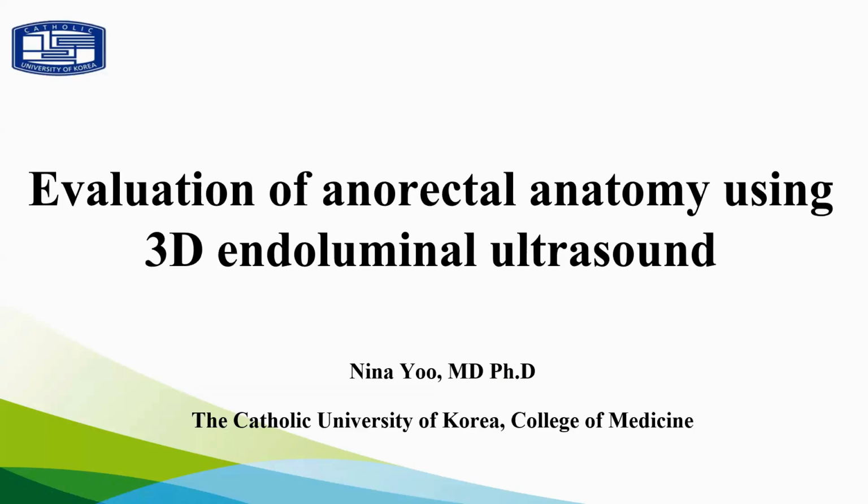It's a webinar, a special one in that way, talking about the evaluation of anorectal anatomy using a 3D endoluminal ultrasound scan. Our speaker is Professor Nina Yoo from Korea, and she's kindly joined even though there's a large time difference between where we are and where she is. We're very grateful that she sacrificed this time to give us this talk.